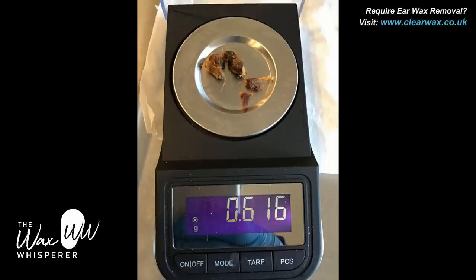I've weighed all the wax and there's quite a fair amount — over half a gram: 616 milligrams, so 0.6 of a gram.